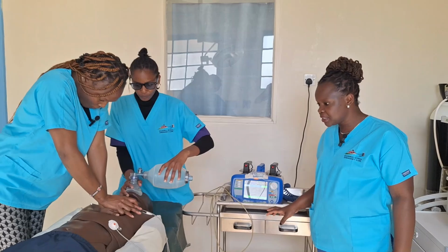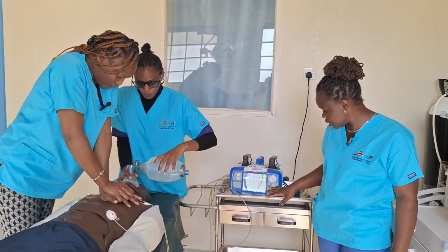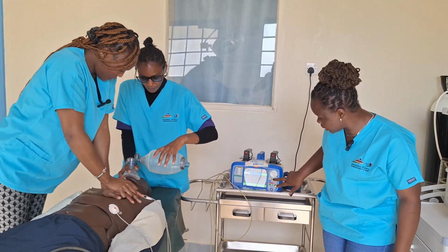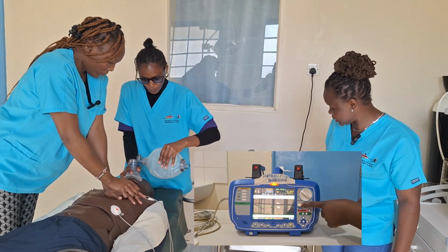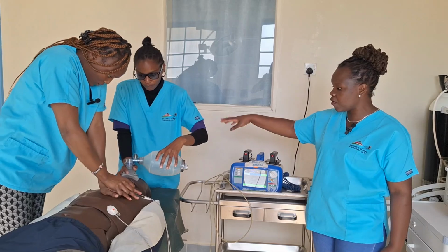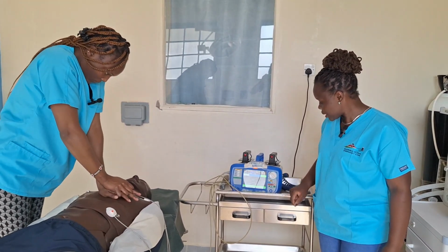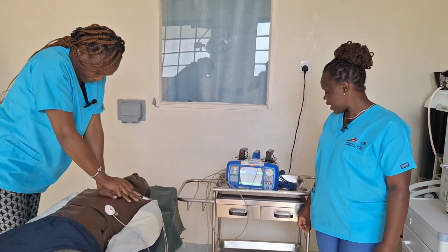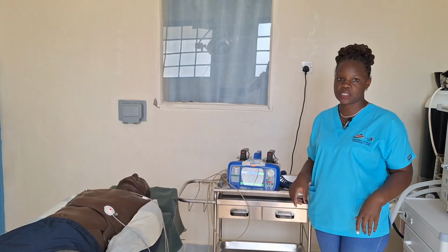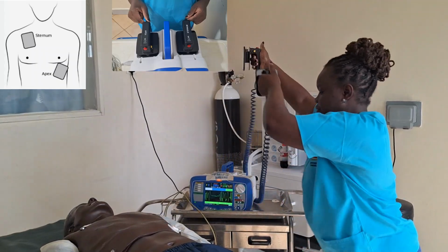So we've identified that the patient is in cardiac arrest and we have a shockable rhythm. I will proceed to choosing the energy level that I want to use to shock the patient, and we start with 200. At this time, I'll ask the person managing the airway to keep oxygen and everything off the patient. Then I'll proceed to charge the defibrillator, and I'll ask Jackie to stop compressions and step away so that we can deliver the shock. Deliver the shock, continue CPR.